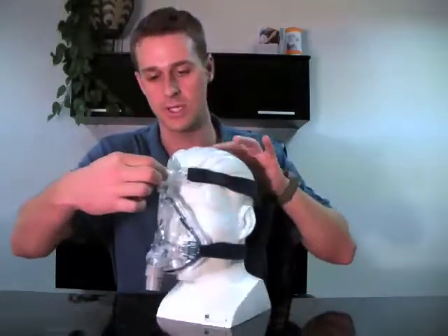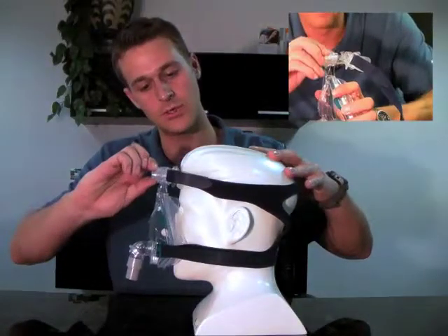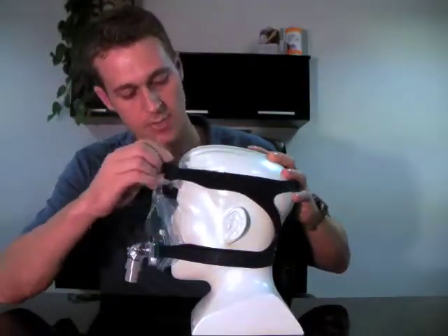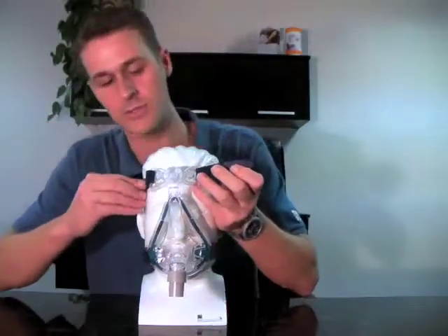To adjust the mask, there are a couple things that you can do on the Mirage Quattro. The first is that you can turn this knob here, which will adjust the way that it rests against the forehead. It also can be adjusted by tightening these straps on the side. Typically these straps should be adjusted at the same time so that you'll get an equal fit.